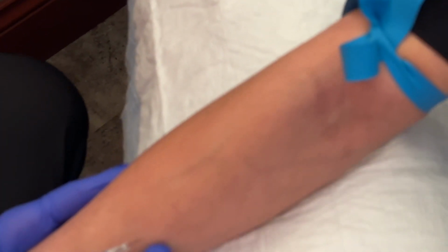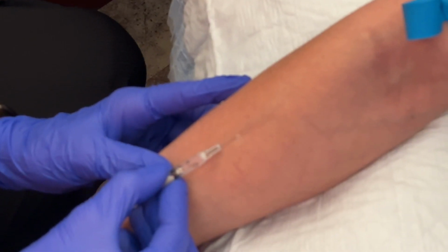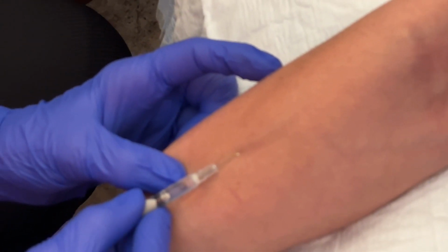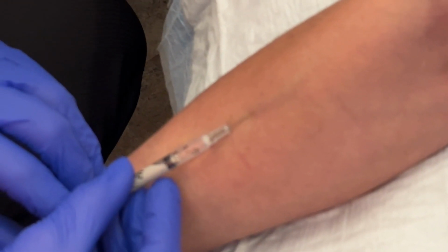I'm going to scoot you towards me just a hair. You see we've got a nice vein here. We're going to come right below. You don't want to inject into it, and you don't want to get too close to the vein because you can vasoconstrict it. So you're going to come right below it. Just the bevel goes underneath the skin, and it's a very slow injection.